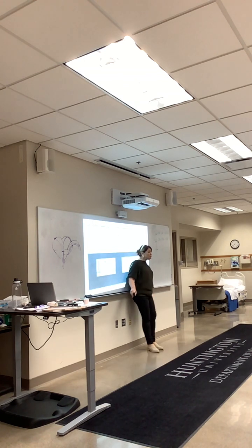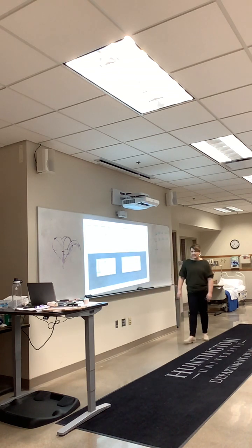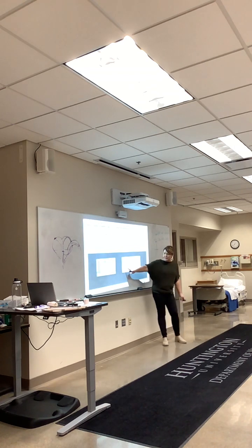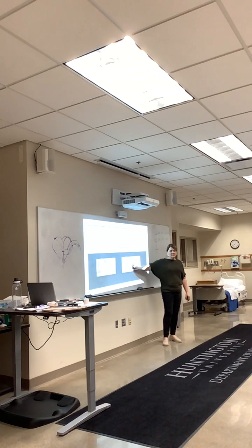You'll have telemetry monitors pick it up and say this is 1, 2, 3, 4, 5, 6 beats instead of a 3 beat because it gets so tall. So just kind of keep that in mind as you're going through that. This one, here's my P wave, here's my QRS, this is my T wave. Right? So this is your potassium at 7 or something like that. It gets really, really peaked. So this is when something bad's going to happen to your patient.